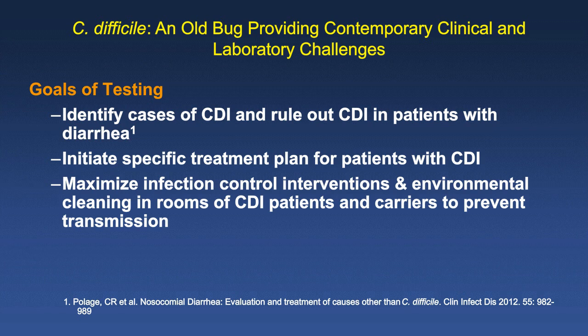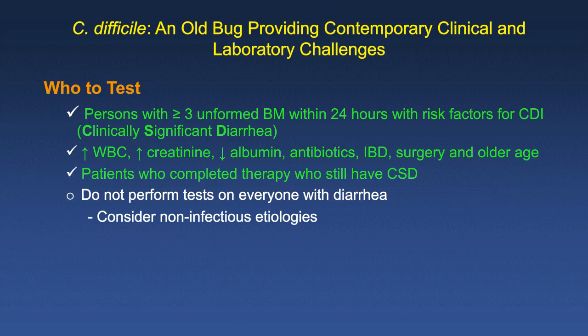And again, can't say enough about the role of infection control, both in the initial phase of management of disease, and then we'll make a comment about the potential role of infection control on the follow-up. There has been much discussion, certainly before the guidelines, and there will continue to be discussions after the guidelines, about the appropriateness of testing. And I think my colleague outlined the important concerns for that.